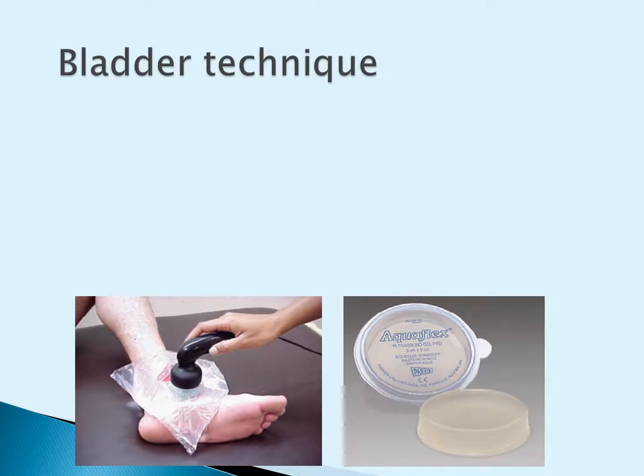This is the bladder technique. For the bladder technique, we're going to use some sort of medium. Typically what we're going to show is using a glove with gel on either side of it, but this here is actually a traditional bladder that you can buy for ultrasound.